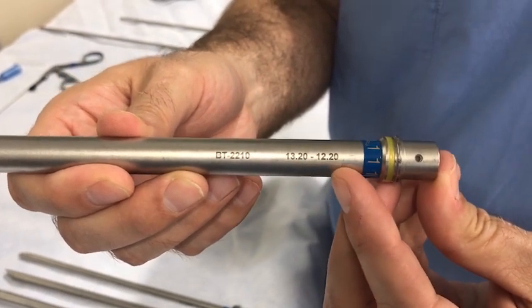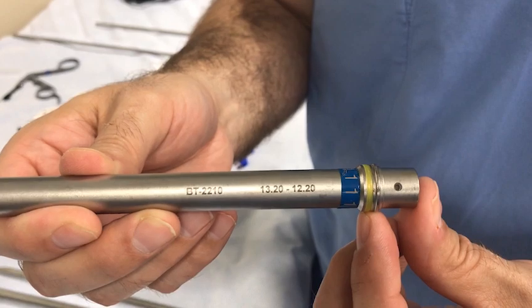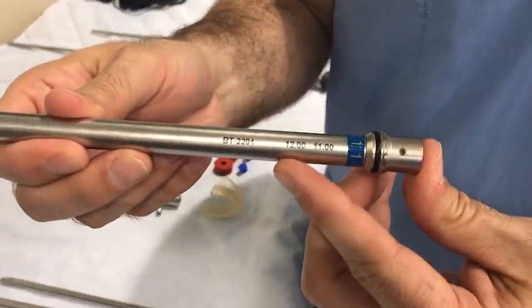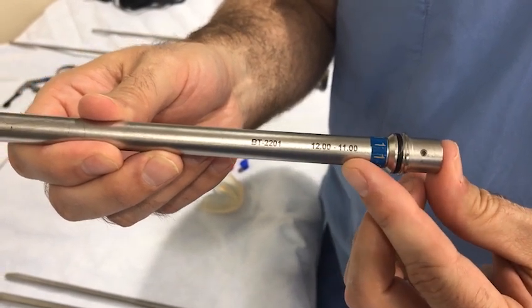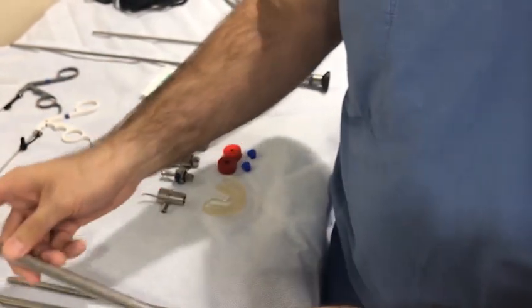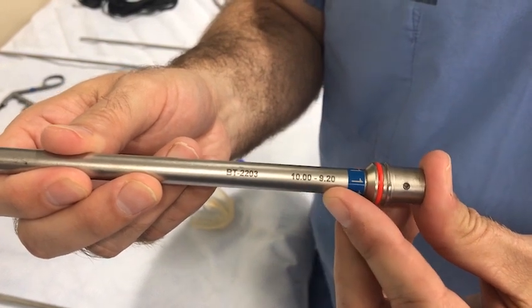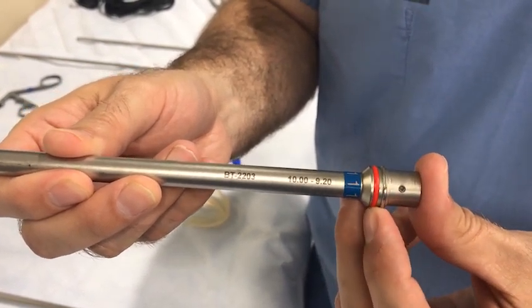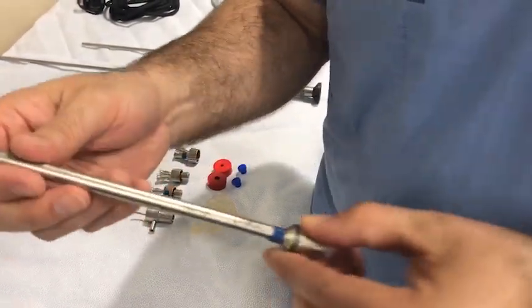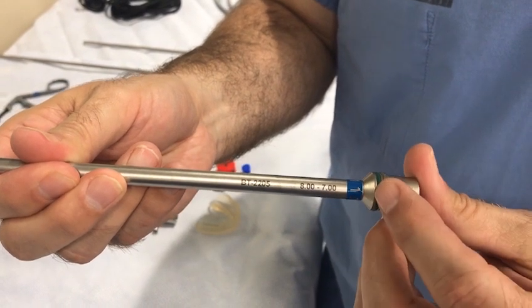This is the largest tracheoscope diameter with an internal to external diameter of 12 to 13 millimeters, marked with a yellow stripe on the proximal end. The black scope has an internal to external diameter of 11 to 12 millimeters. The red scope has an internal to external diameter of 9 to 10 millimeters. The green scope has an internal to external diameter of 7 to 8 millimeters.